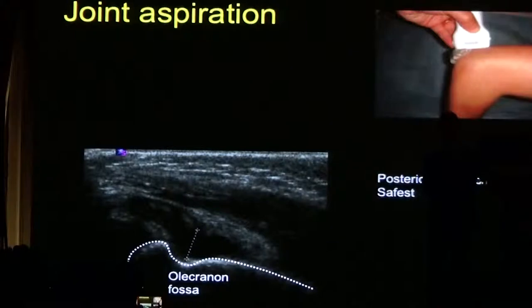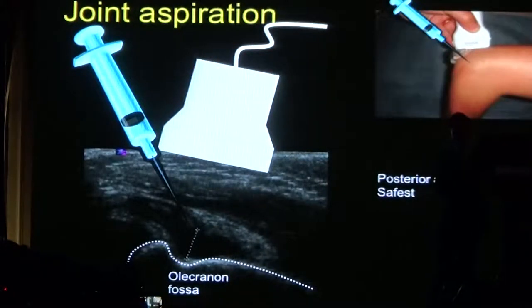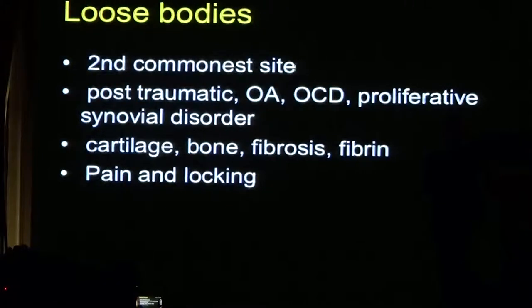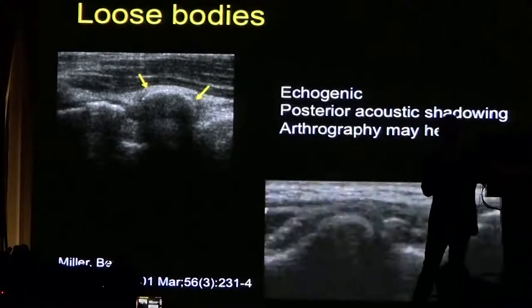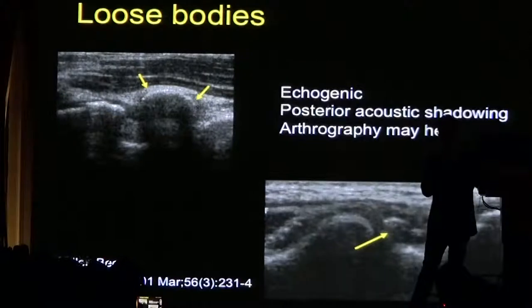This is the posterior approach I would use for obtaining fluid from the joint. Loose bodies are common within the elbow — often they are post-traumatic, but they can be related to osteoarthritis and synovial proliferative diseases. Loose bodies may be comprised of cartilage, bone, or fibrosis, and patients will present with pain and locking. Loose bodies typically look echogenic with posterior acoustic shadowing, and sometimes performing an arthrogram may help make the diagnosis. You can see the loose body sitting within the fossa with posterior acoustic shadowing.